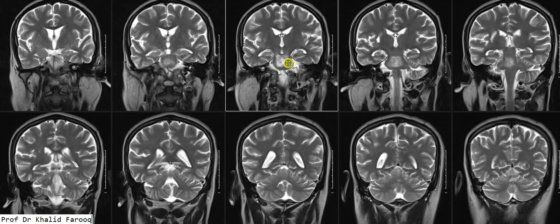We can also see ischemic changes involving the right basal ganglia extending into the right periventricular region. The corpus callosum, frontal horns of the lateral ventricle, third ventricle, and both thalami are unremarkable. The medulla oblongata and midbrain are normal.